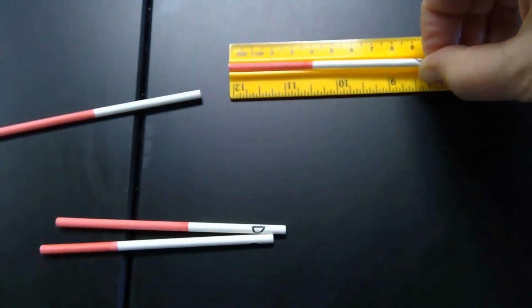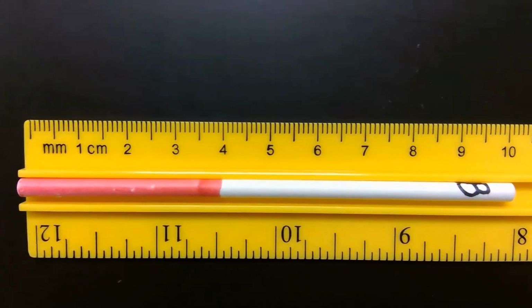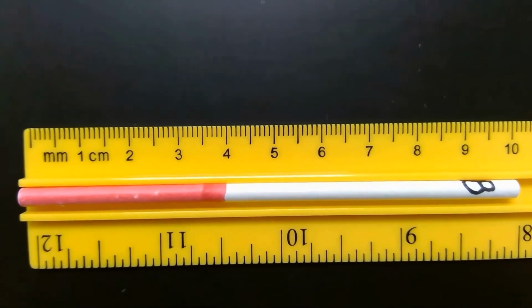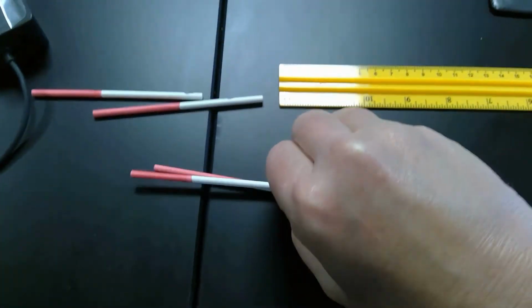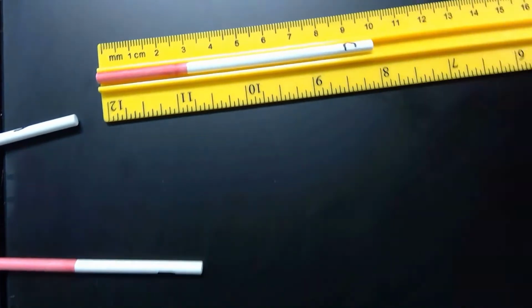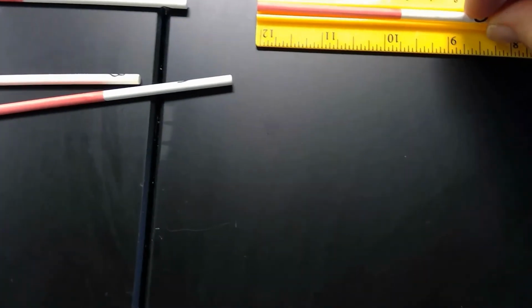Here's tube B. You would just put it on here. You see the total is 10. You look at how far the red comes up, and you divide. So this one has a 40% hematocrit. Here is C. This time you figure out the hematocrit. And here is D.